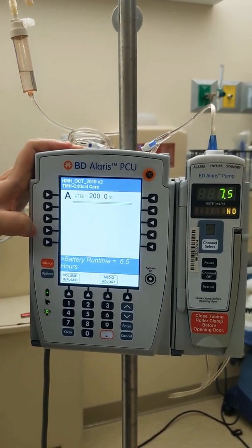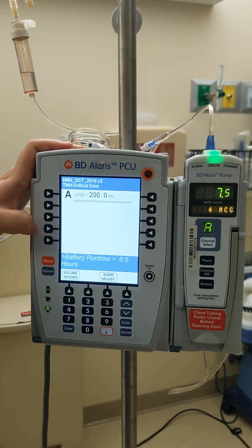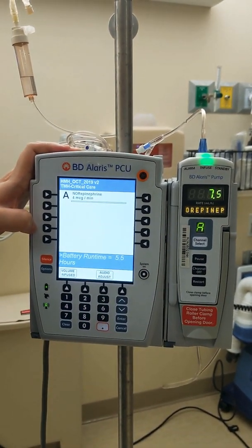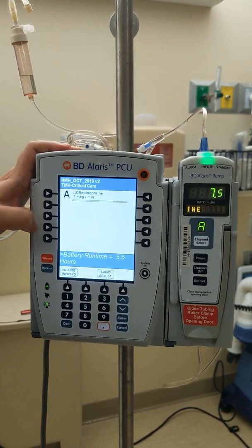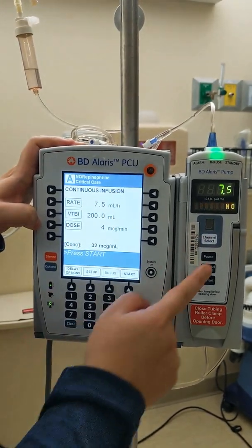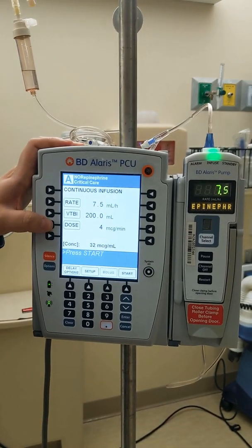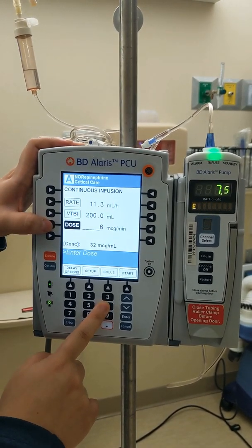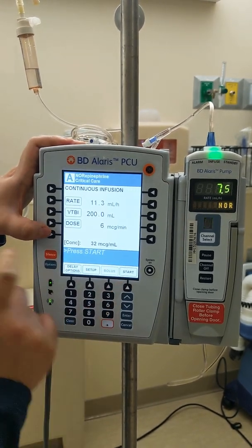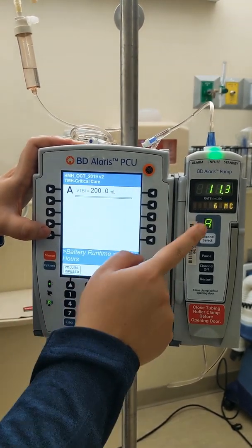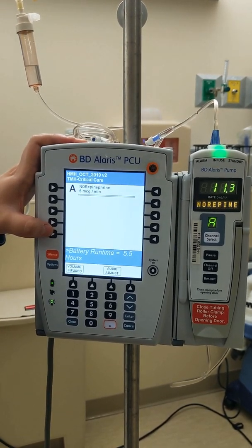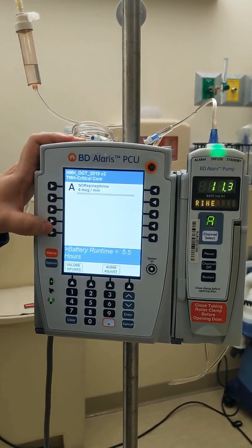Let's get that started. Now it is going at 4 mcg per minute. A few minutes later, your patient's blood pressure is not improving, so I'm going to go ahead and titrate the pressor up. I'm going to do channel select and go up to 6 mcg — see, it calculated that for you, so you don't have to enter the rate manually. Hit start. Now it is going at 6 mcg per minute. That's how you do titrating up and down.